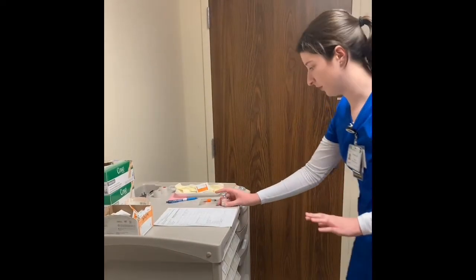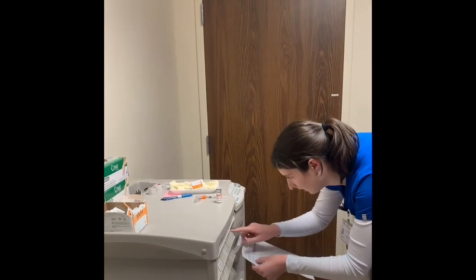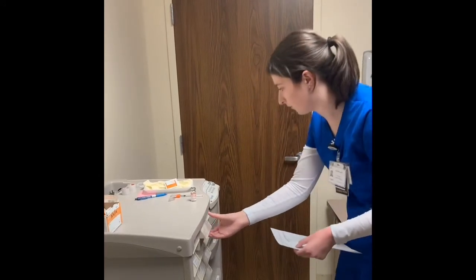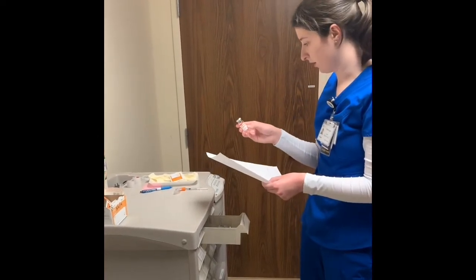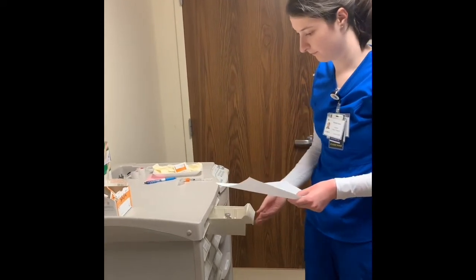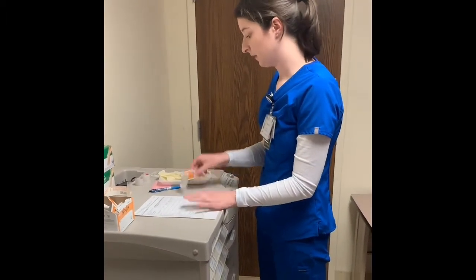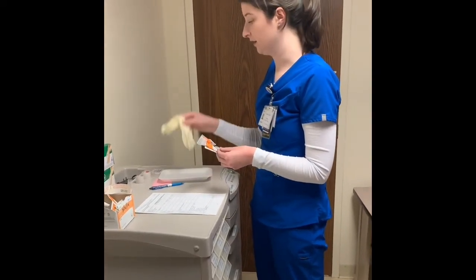So just to double check the drawer that I'm putting this in, the patient is Carmen Guadalupe. Date of birth is 2/2 of 92. Patient ID is 535451130. So this is the correct drawer. And I am replacing a vial of regular insulin, 100 units per milliliter, which is what I have in my hand right here. Okay. So now I'm ready to go into my patient's room. So I'm going to take with me my MAR, my medication that has been prepared, my alcohol swab, and my gloves.